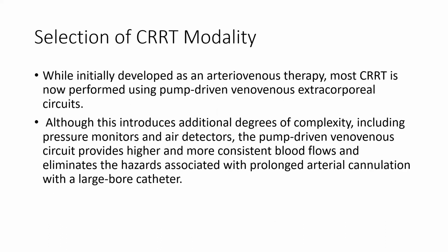Now, the selection of CRRT modality. While initially developed as an AV, arteriovenous, therapy, most CRRT is now performed using a pump-driven veno-venous extracorporeal circuit. Although this introduces an additional degree of complexity, including pressure monitors and air detectors, the pump-driven veno-venous circuit provides higher and more consistent blood flow and eliminates the hazards associated with prolonged arterial cannulation with a large bore catheter.